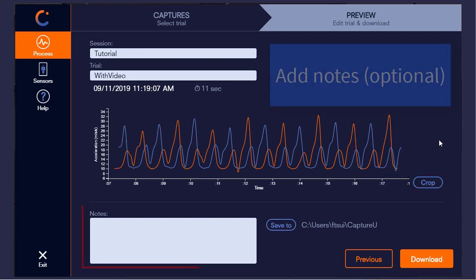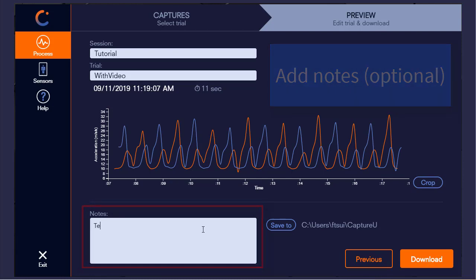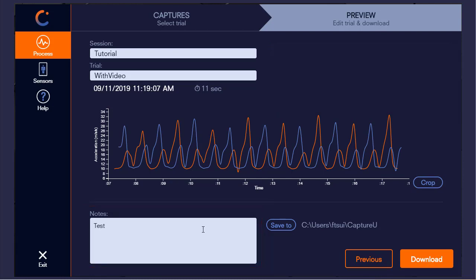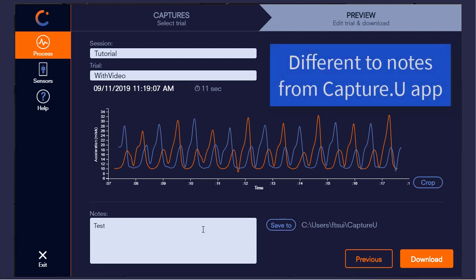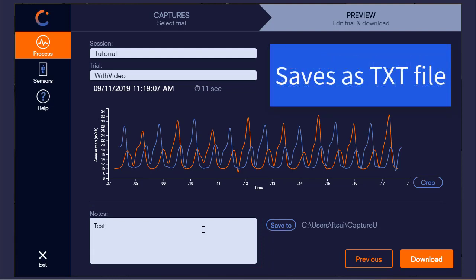At the bottom, there is the option to add in notes. These are different to the notes added within the CaptureU app and will get exported as a text file within the session folder.